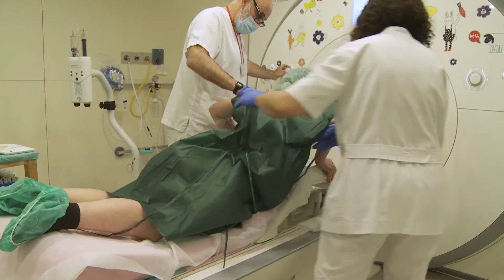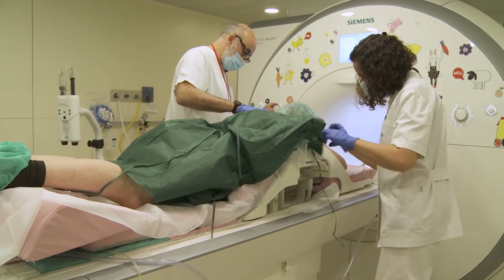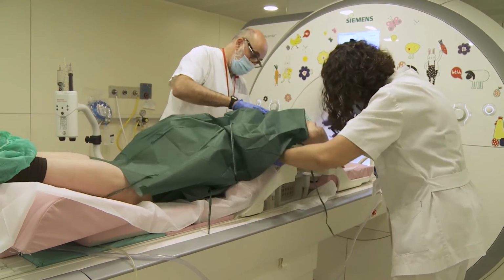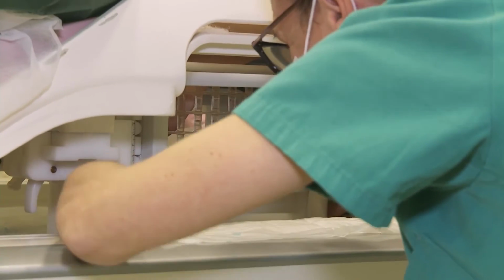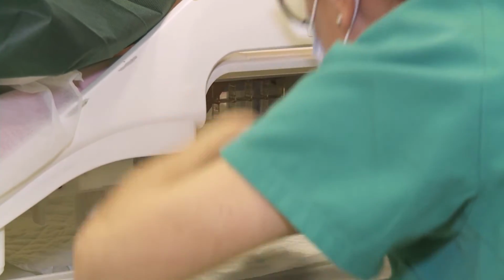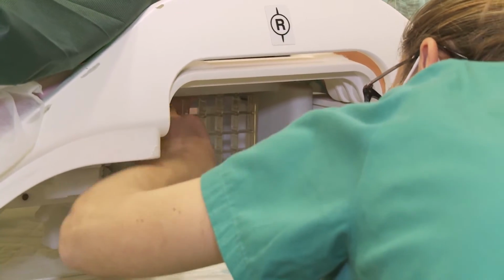Patient is placed prone on the MRI table. Right breast is placed in the dedicated right coil slot to allow external access. The Sentinel interventional grid is used. The compression grid is moved manually so that the breast lesion is accessible and the breast is compressed.